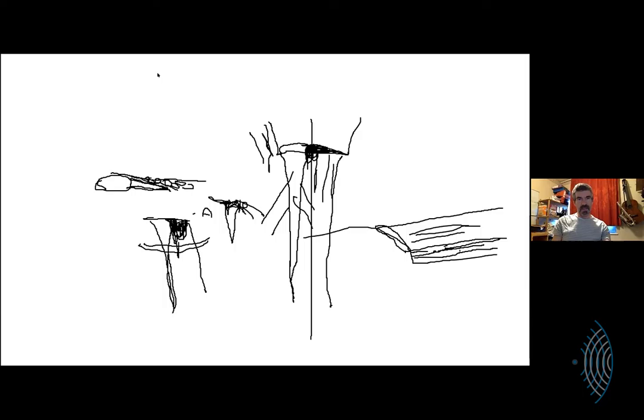So when you move the probe, you're looking for, am I following pixels or am I going from pixel to pixel to pixel? So you don't get this bit all stripy, this bit isn't. When you turn into short axis, if I can erase, there's usually a clear button.